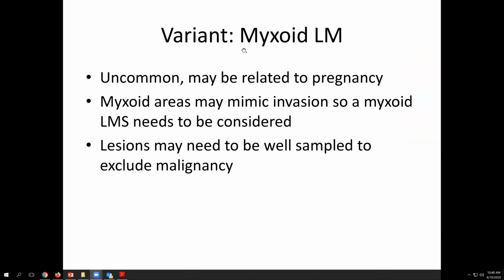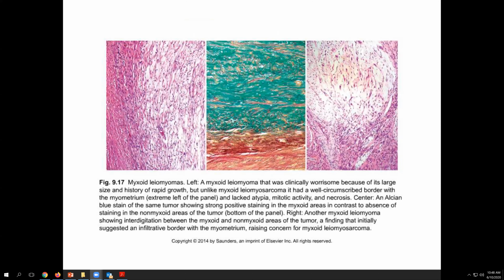The actual myxoid leiomyoma is relatively uncommon, and these myxoid areas may mimic invasion. So a myxoid leiomyosarcoma needs to be considered in the differential. So these should be well sampled to exclude malignancy.